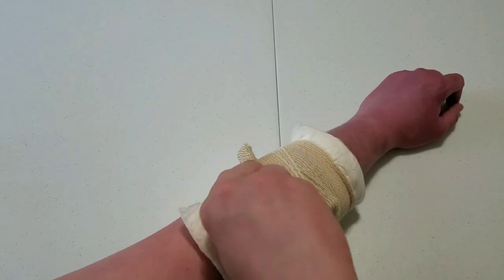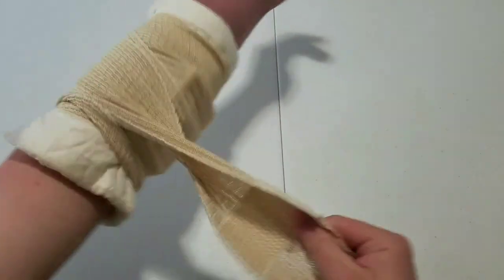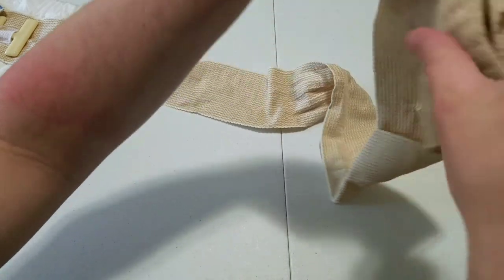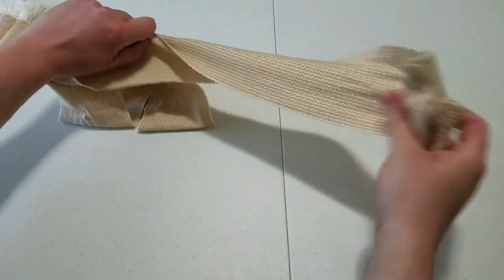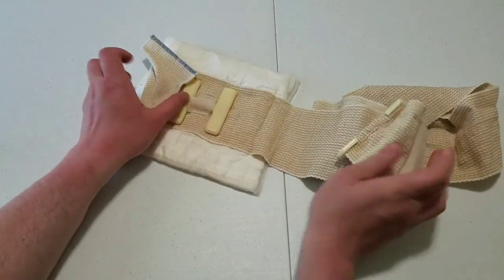Something I want you to take note of is I'm wrapping this around the smallest part of my body — my lower arm. Both of my lower legs, thighs, upper arms, and my torso are all much larger than this lower arm, but I ran out of wrap before I could even cover this pad. So what if I was putting this on my torso? For an abdominal injury, which is really what this one is most prominently used for, I only have enough of this stuff to get around a normal-size person one time, maybe one and a half times. I have about 6 feet of wrap and that's it.